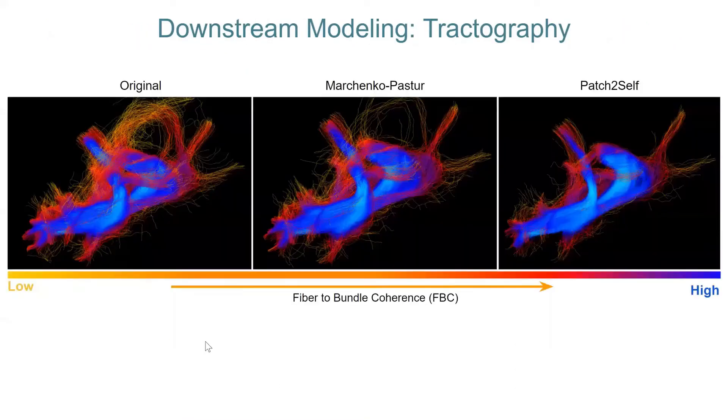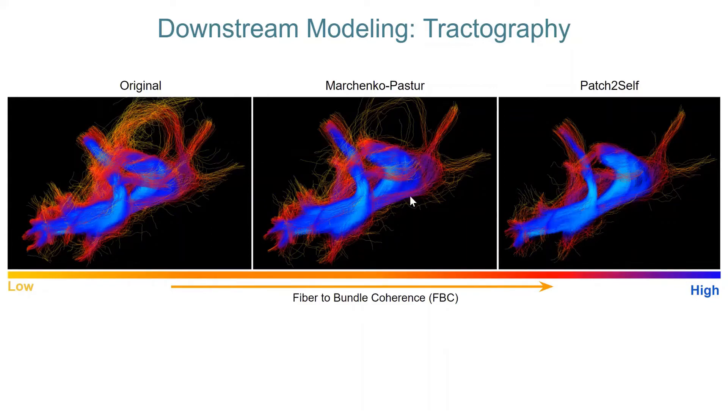Then when we look at tractography, you see that the original data, which had a lot of false positives, like the yellowish red lines that you see in the optic radiation bundle, they reduce as the denoising result improves. There are some that are there due to Marchenko-Pastur PCA, but Patch2Self, they go away a little more.